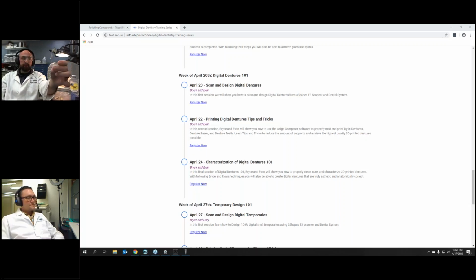We had a question come in from Anthony. Curing question, can I use my Triad 2000 or Intera triple light cure? At this time, no, because they're not what's been approved through our IFU with the FDA. That's not to say in the future that we won't add more to it.